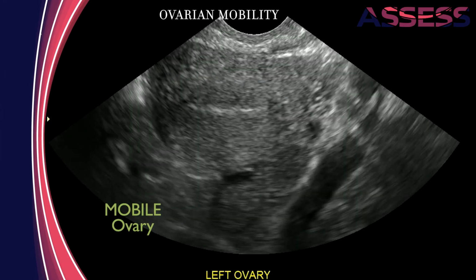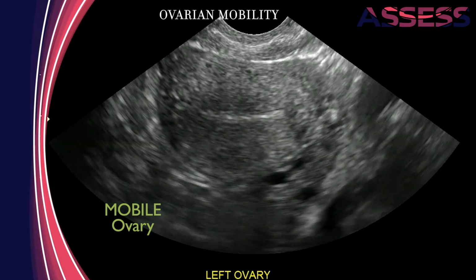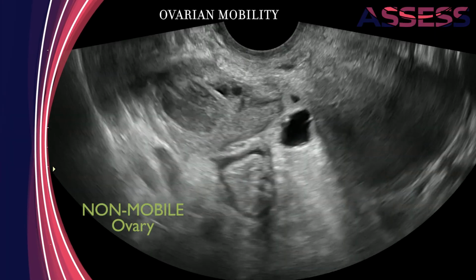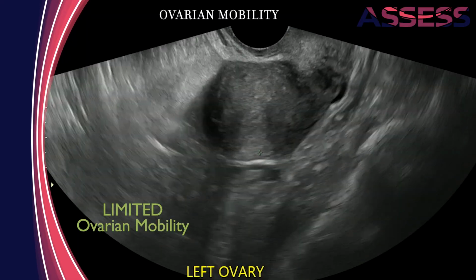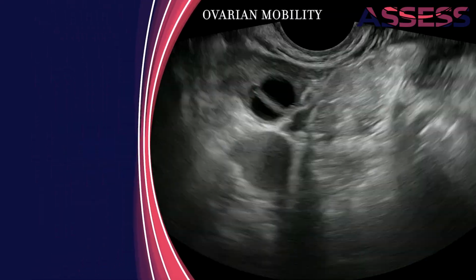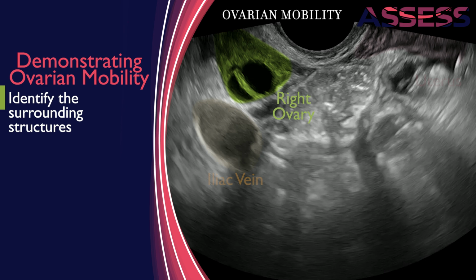When the ovary and surrounding structures move freely, the ovary is mobile. When structures are tethered and do not move freely, the ovary is non-mobile. If you are unable to show or evaluate ovarian mobility, this may be limited ovarian mobility. To demonstrate ovarian mobility, locate the ovary, identify the surrounding structures.